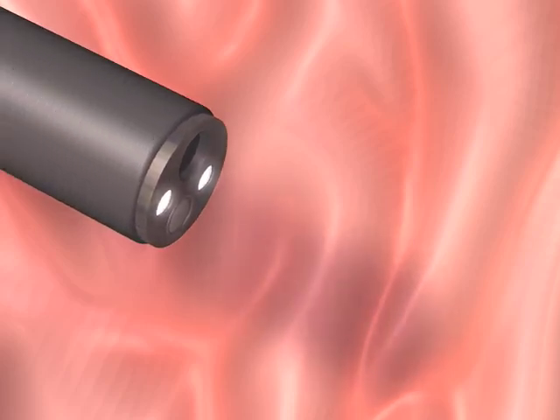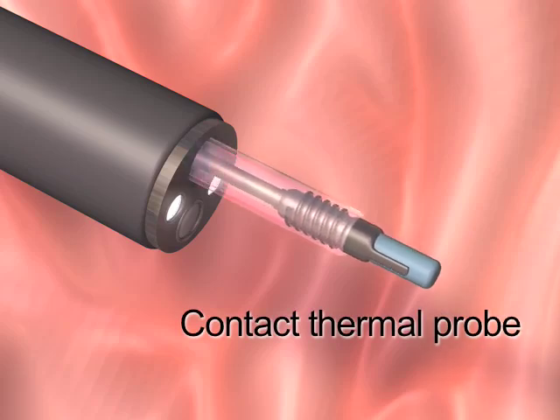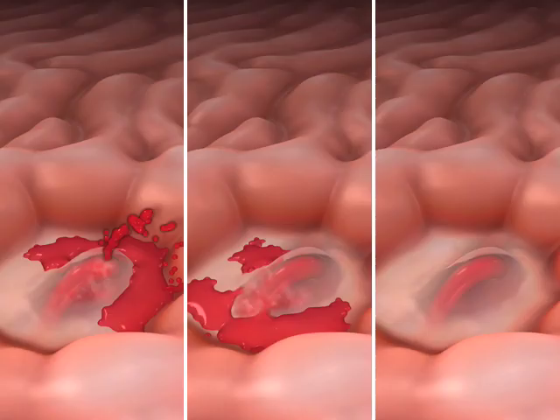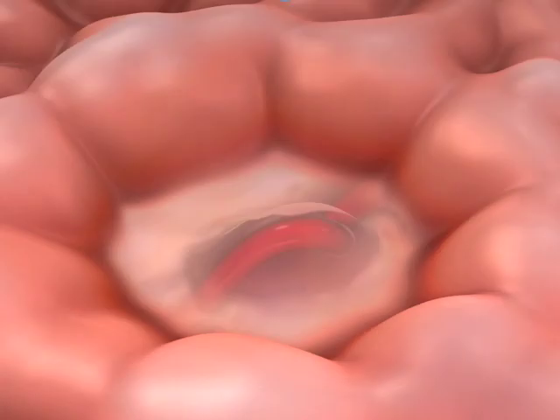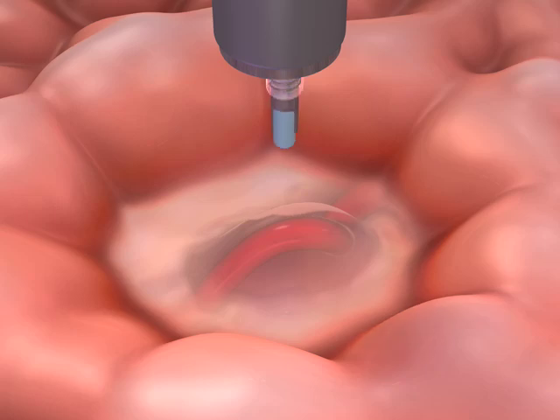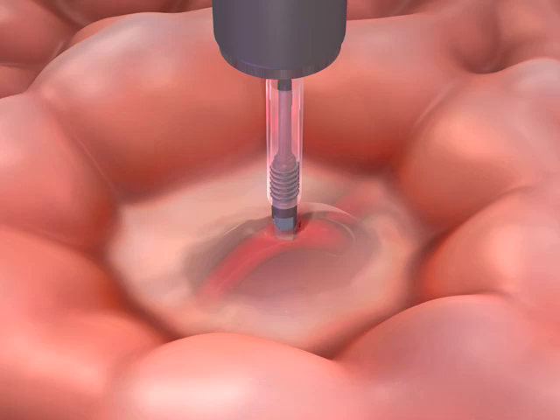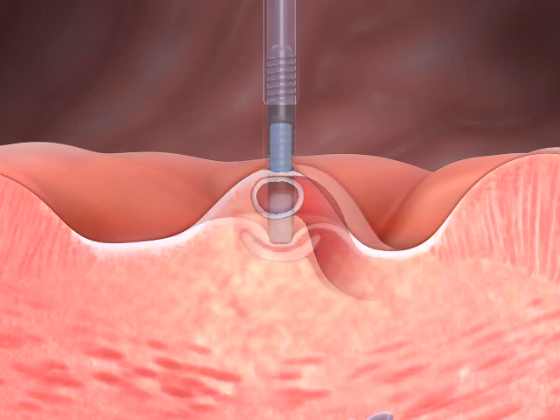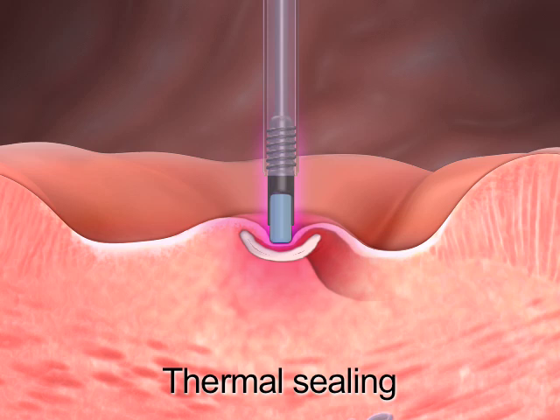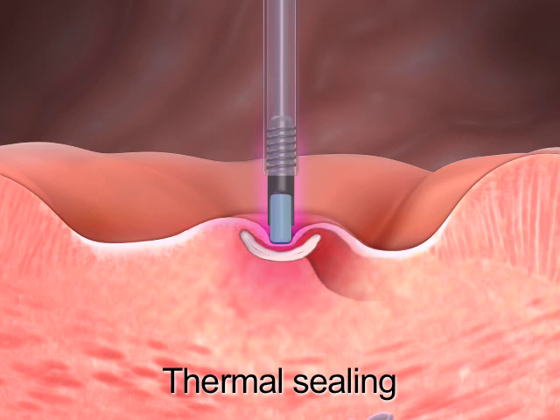This animation demonstrates the use of a contact thermal probe. A large, 10 French probe is recommended. It has been placed into the working channel of a large, single-channel or double-channel therapeutic endoscope. The target site may appear as an active bleeding vessel that is spurting or oozing, or as a non-bleeding visible vessel. The probe should be placed directly over the target site and pressure applied to cause indentation of the targeted tissue with compression of the underlying vessel while delivering thermal energy. This action is referred to as co-aptive coagulation, and its aim is to weld the artery shut.